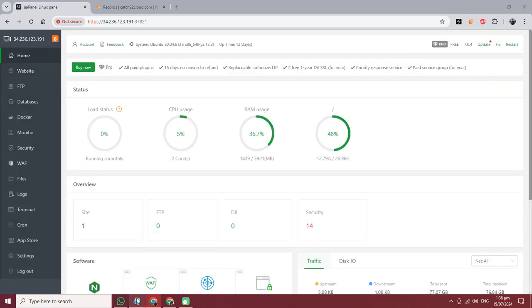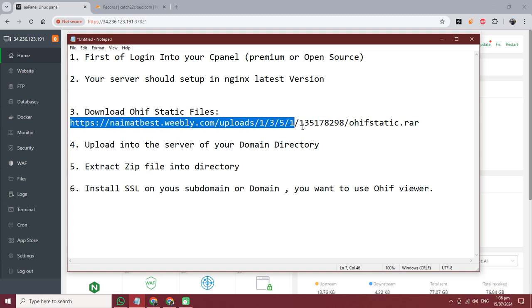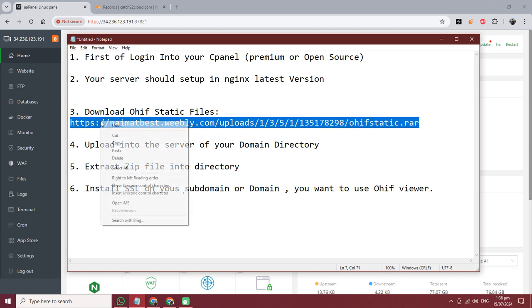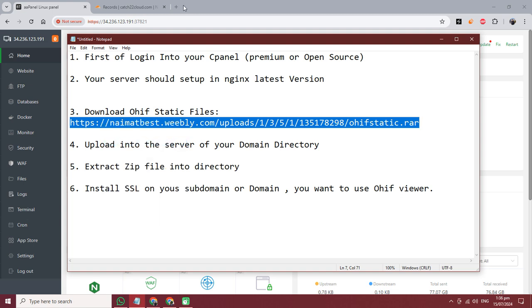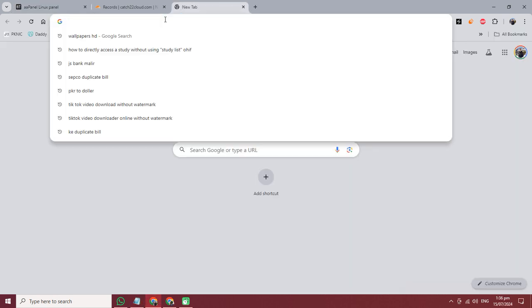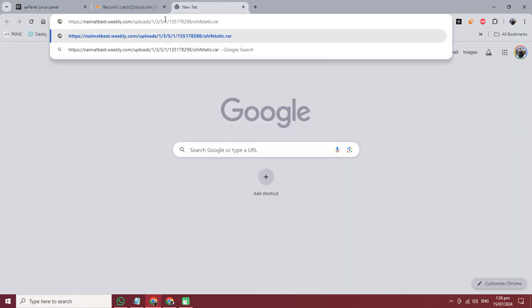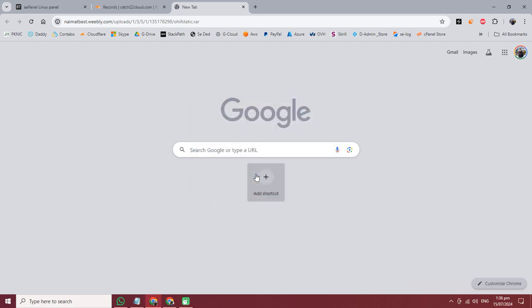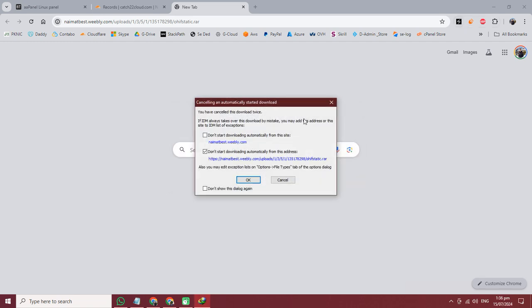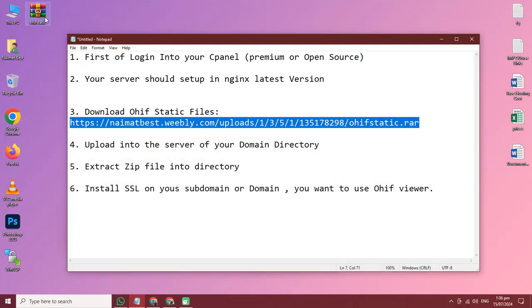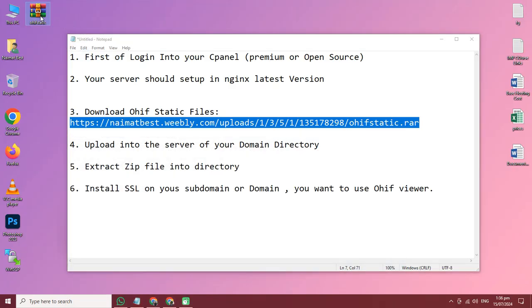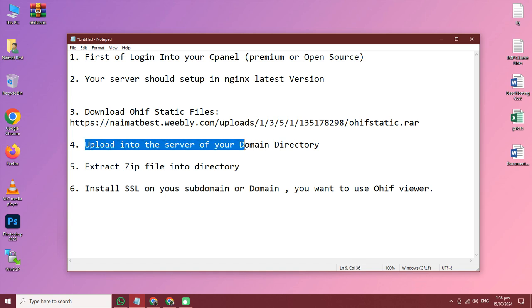After that, step three is to download the static files of OHIF viewer. I have already downloaded the OHIF static files on my desktop, so I am canceling it. Here are the folders already downloaded. After downloading, upload it.